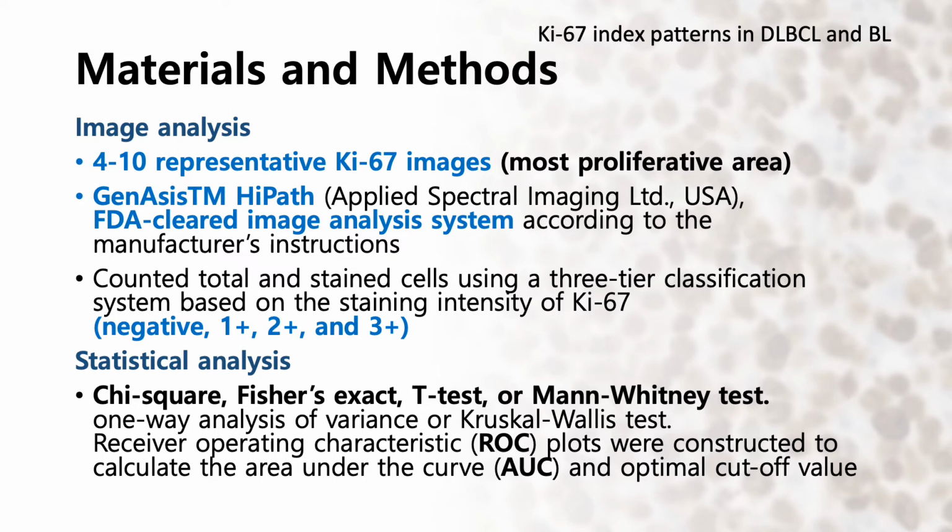We compared the patterns between DLBCL and Burkitt lymphoma, ABC and GCB subtypes of DLBCLs, and Burkitt lymphoma and DLBCL with high proliferation index.